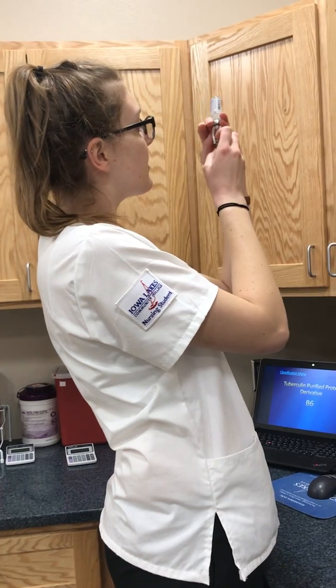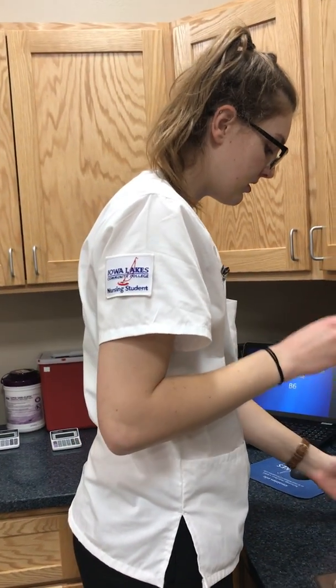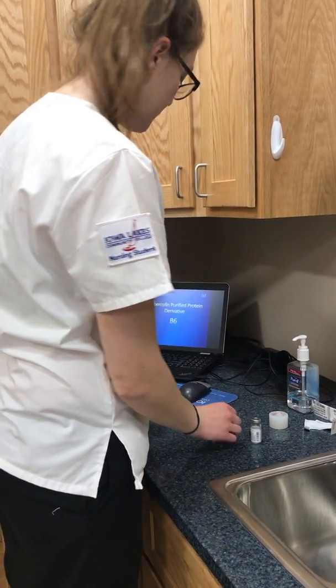It does not seem that there are any air bubbles, so I'm able to withdraw it. I'm going to recap because it has not been in the patient, so with swoop and scoop.